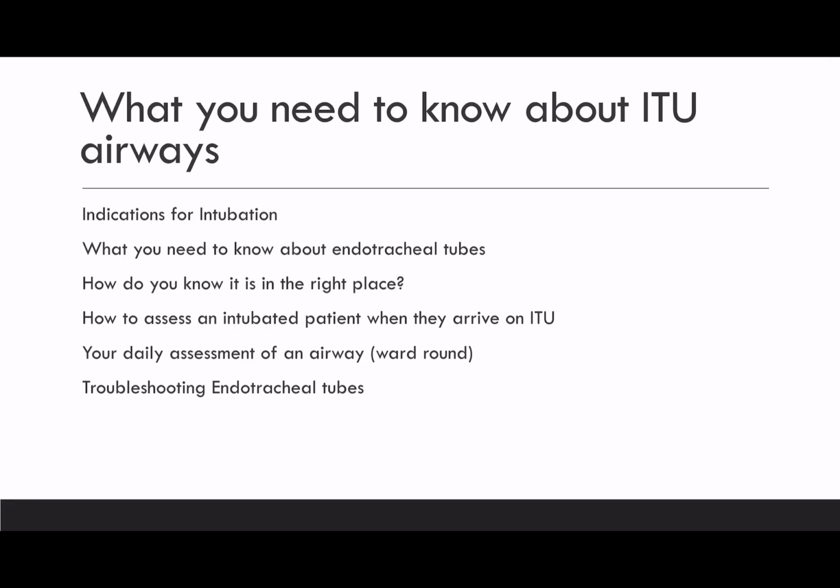Throughout this talk, what I will do is talk a little bit about the indications for intubation. I think this is important because not every patient on intensive care is intubated. Sometimes we bring patients into intensive care to monitor them and to see whether they do deteriorate, in which case we will intubate them. And therefore, as a junior looking after these patients, it's useful to know what the triggers are for thinking about intubating them so they can escalate to a senior at an appropriate time.